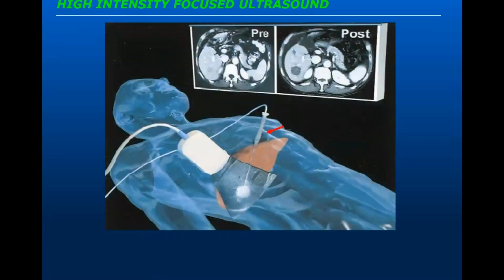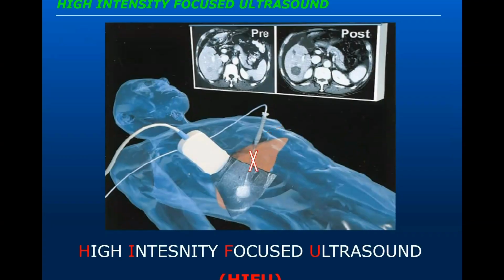So far we have talked about microwave and radiofrequency ablation, and we said that the beauty of this is that we can put this through just a needle into the tumor, right? It's a big advantage. But what if I tell you that we also have now a modality where you do not even need the needle? You can just shoot from outside without needing the needle. And this is the beauty of high intensity focused ultrasound, or HIFU.